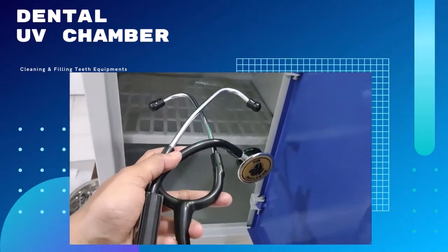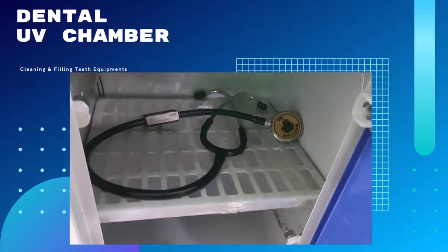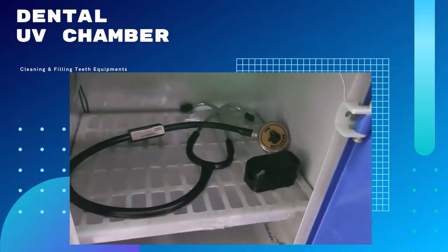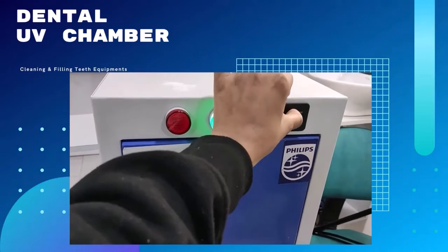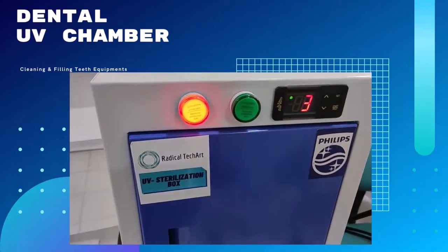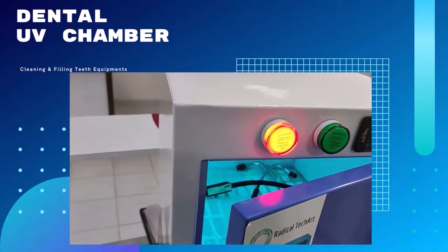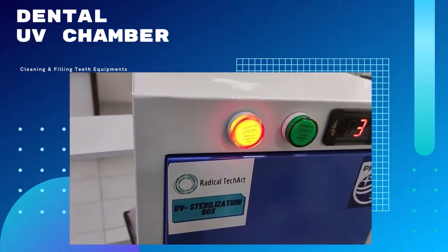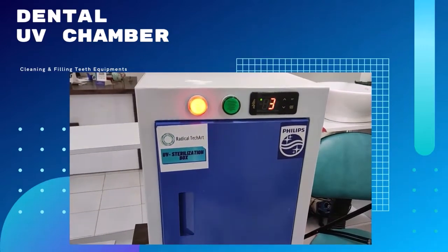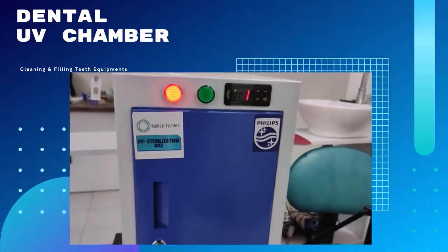Okay guys, so you can see here our product — the UV sterilization box. Here I use my dental instruments for cleaning purpose. You can see here I put the timer for 4 minutes. Now I put all the instruments inside the UV box. This is a sterilization surgical tray and all the instruments are cleaned by this UV chamber.